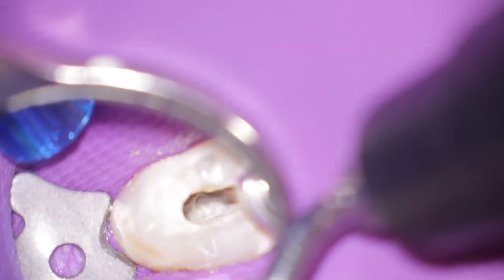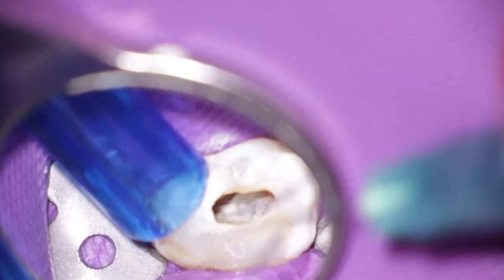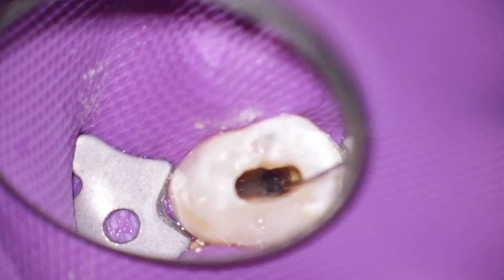With an Endosonic file, which is a cutting file, remember that, you can specifically remove dentine in a very small localized area. With short strokes you can see that I was able to discover the distobuccal canal very easily and quickly. Now you can see the entrance that was covered by sound dentine.